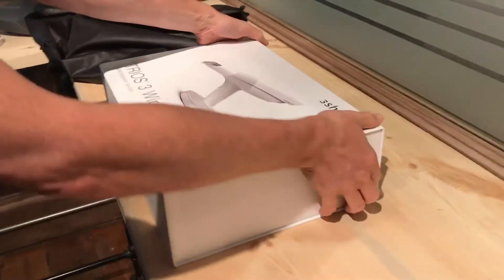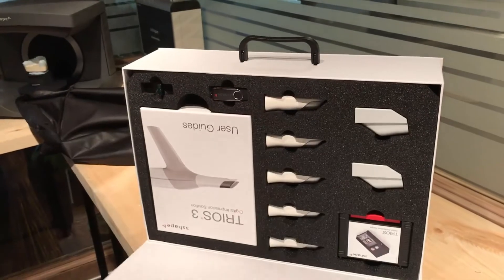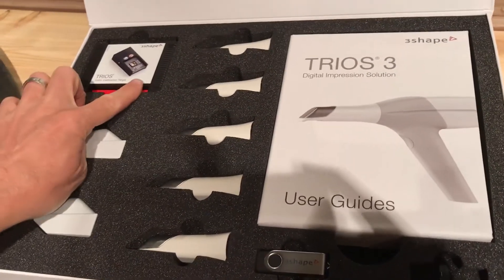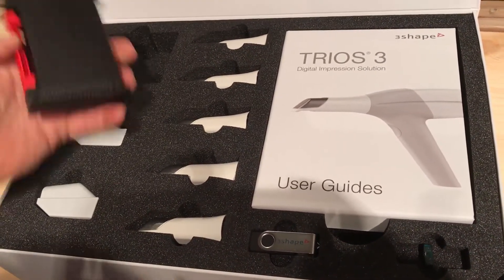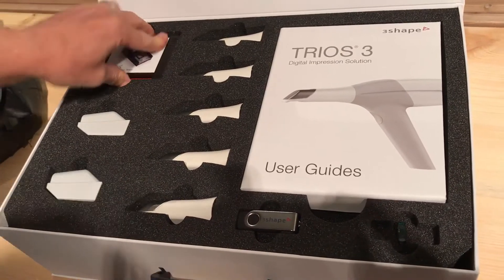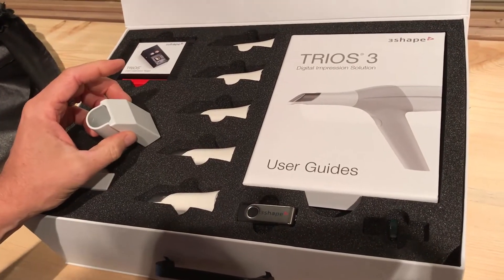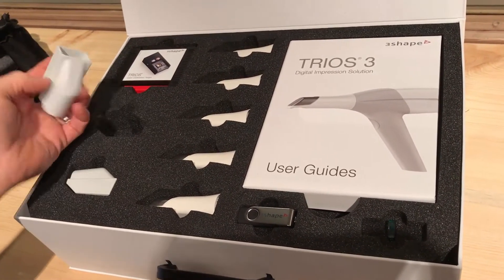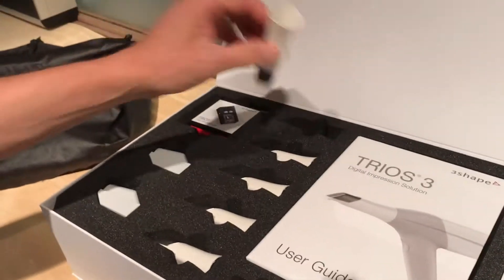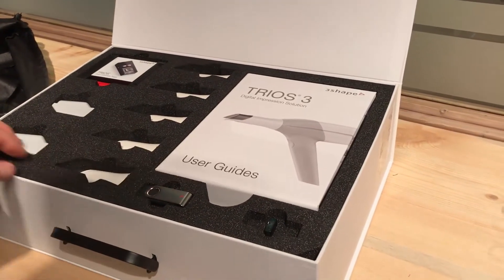The box is very nice — it actually has magnetic little snaps. The first thing we see is the color calibration object or target, which is still the same as the previous wired version. Then you have your actual holders for the tips, and then these are our tips with mirrors that are fully integrated now.